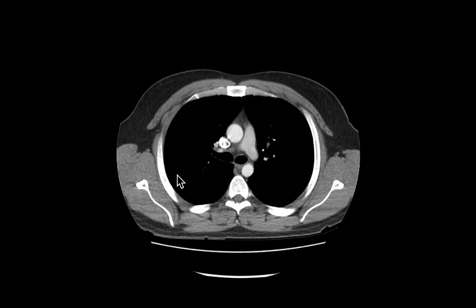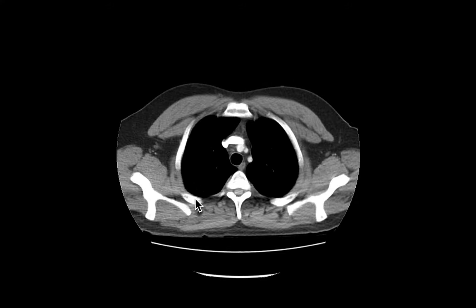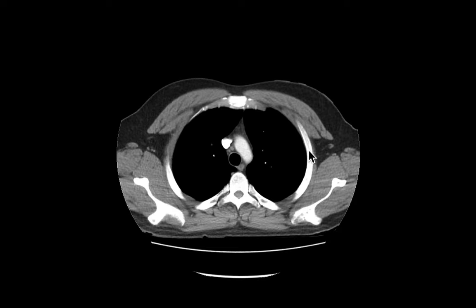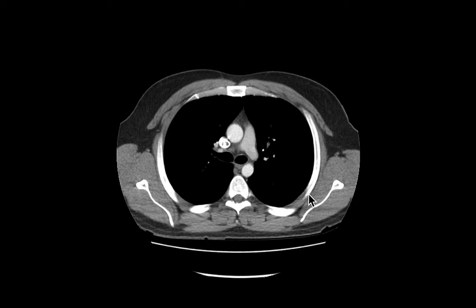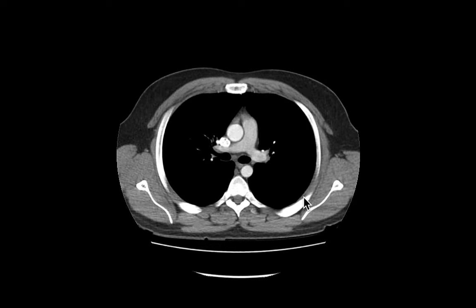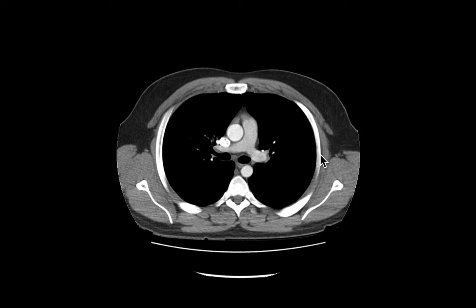And finally, our intercostal muscles — they're between the ribs. We find a rib, and any space between adjacent ribs is where intercostal muscles are located.